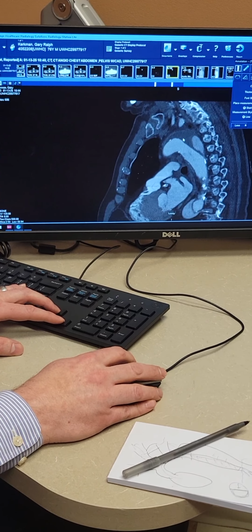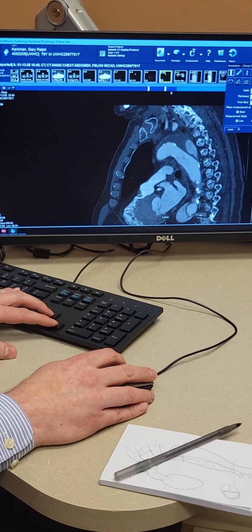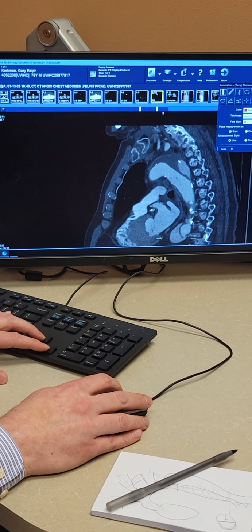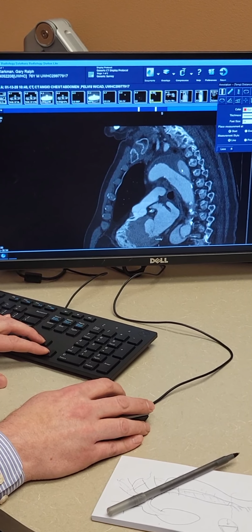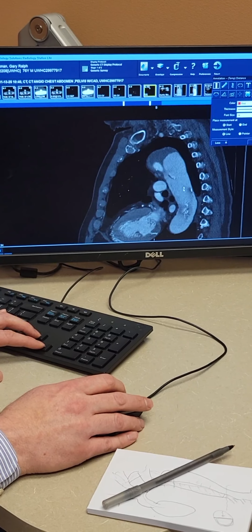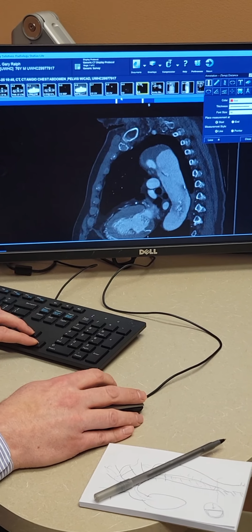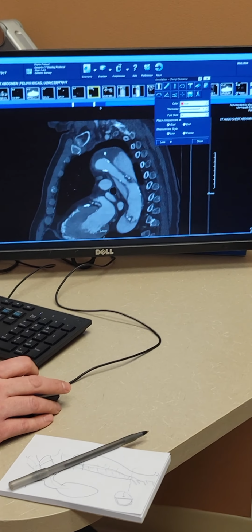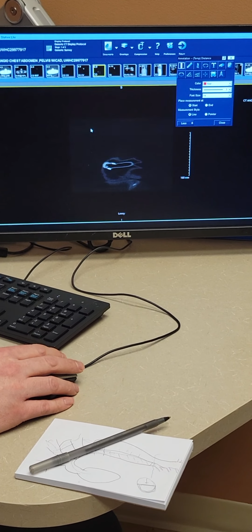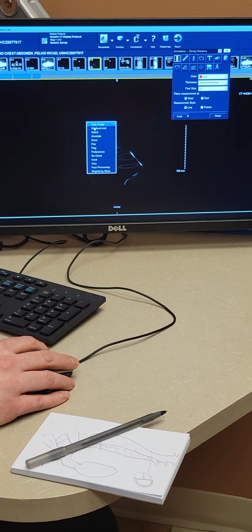There's what we call partial thrombosis because this blood is flowing slow and it's kind of swirling up here because it has nowhere to go that way. It starts to clot. And then there's that false lumen that we were seeing before. And that's what will continue to grow and then eventually burst. And then the final view is just looking straight through the front of you like we're Superman.